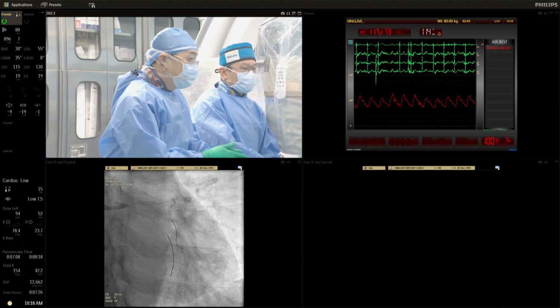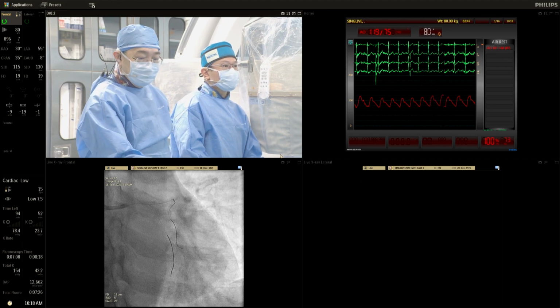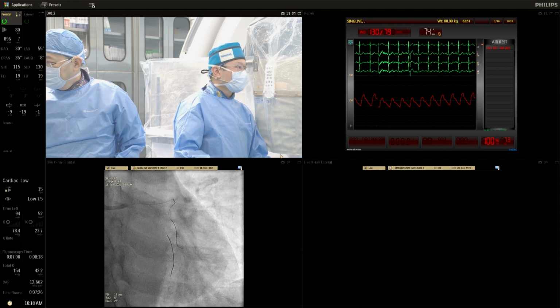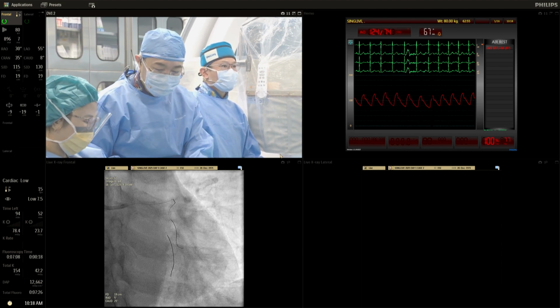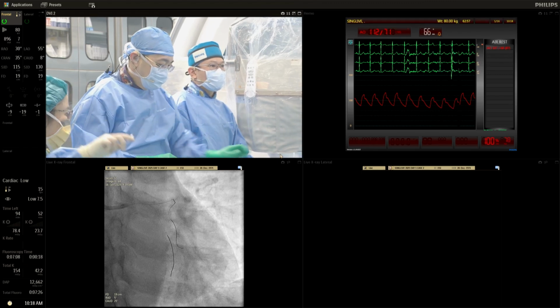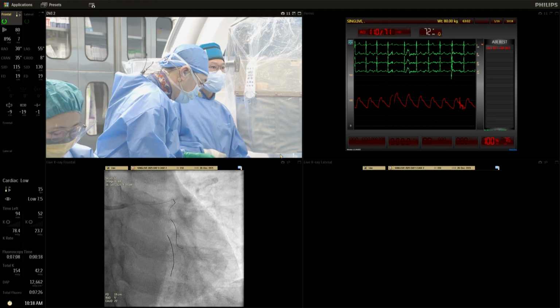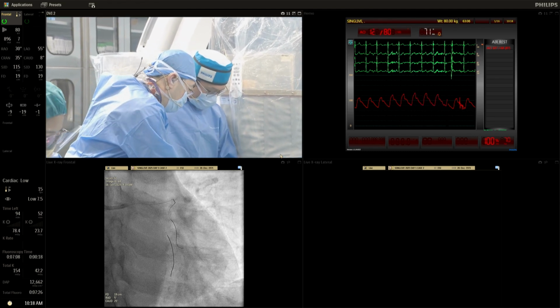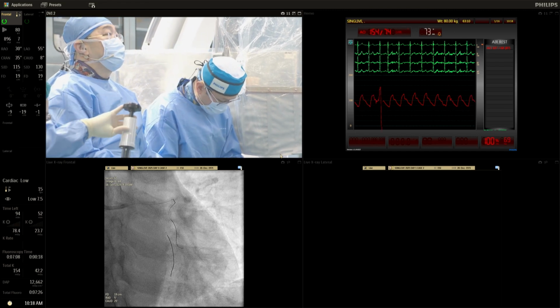I think it's always difficult, especially in this case. Although it's naturally angulated, we have artificially straightened the artery with the wire, so the OCT is going to follow that path. It will be difficult to know, but certainly that's a concern of ours as well. We are cognizant of the transmission time, so we are going to crack on.